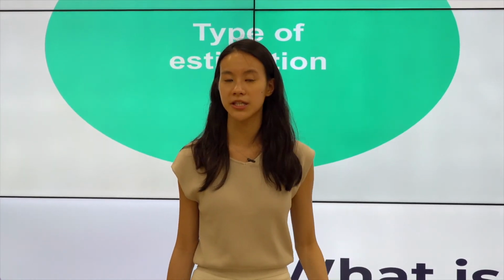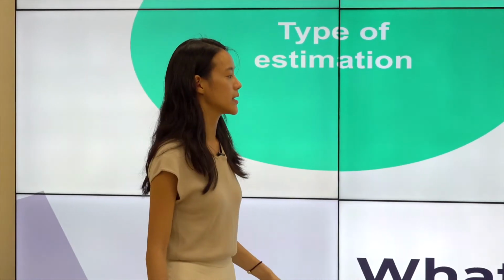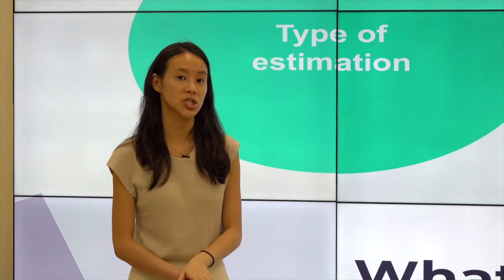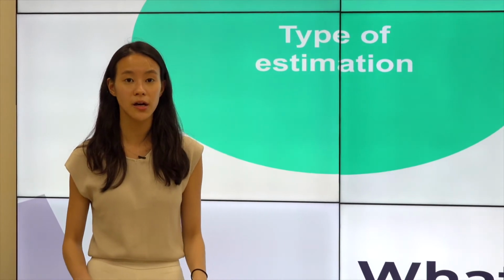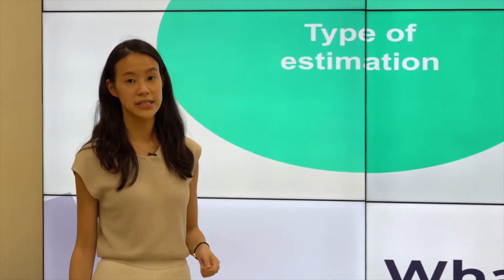For example, if the reference image had 1,000 pixels, and the moving image only had 500, what we would need is interpolation, so that we're able to create an additional point between the two points for that 500 pixel image, so that we can create 1,000 pixels, so that these two images can be registered together or compared together, as we saw in resampling, where we need them on the same grid. That's the entire process, or the entire need or function of this interpolation method.